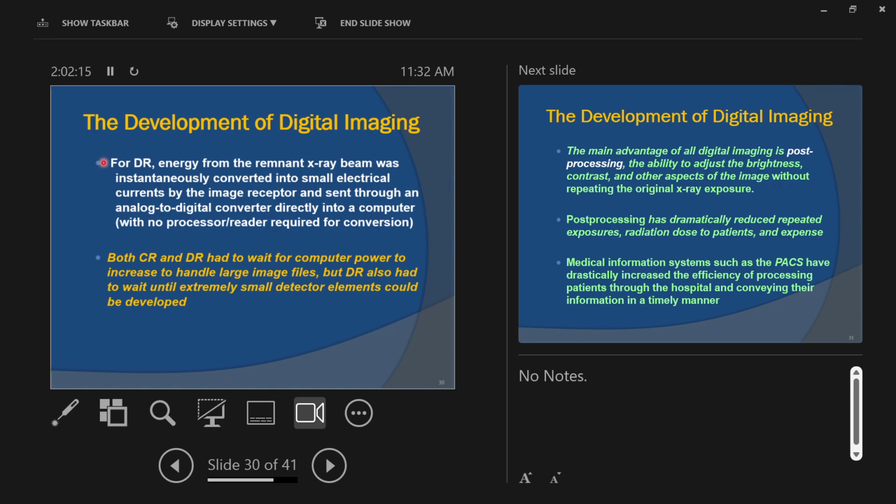Okay. So quick little picture here. We like to draw that as the X-ray tube, okay? So X-ray tube. And we know X-rays come out of that thing, right? So we usually draw something like a beam spreading out away from the X-ray tube, okay? What we'll call this portion of the beam coming out of the tube, we call it primary radiation or the primary beam, okay? So PR is an appropriate little shortened version of that, primary radiation.